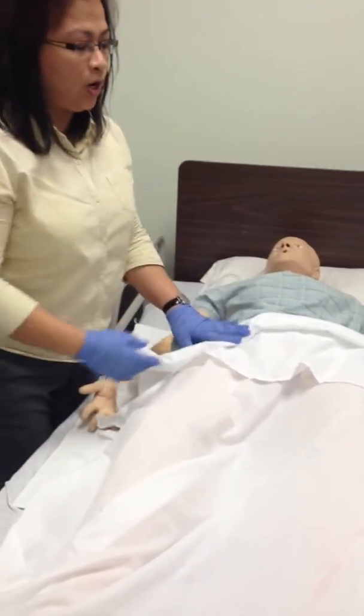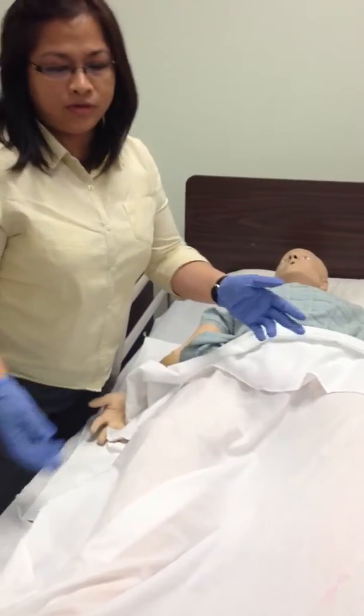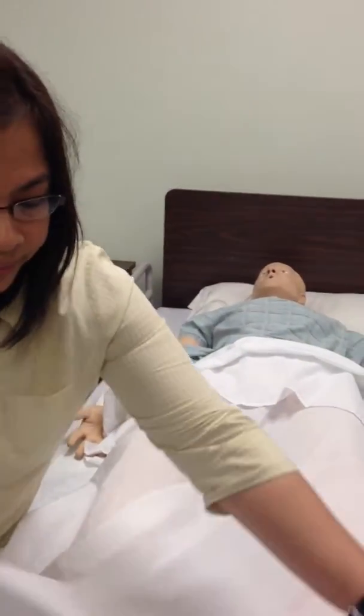All right. So you close that. You're gonna go and fan fold this.